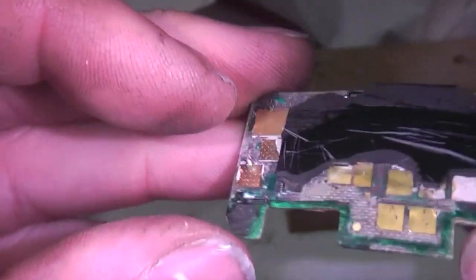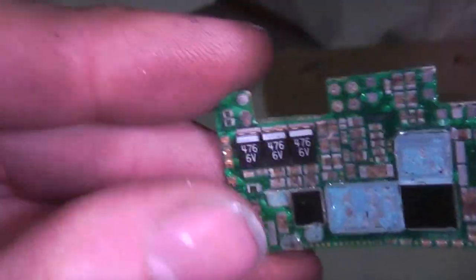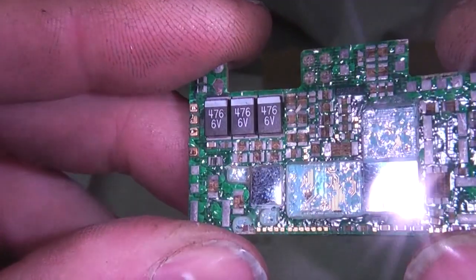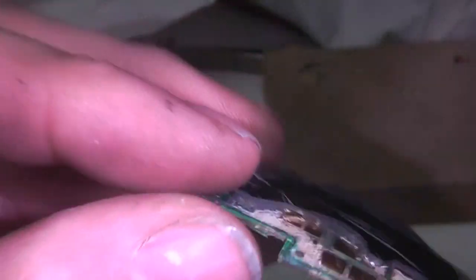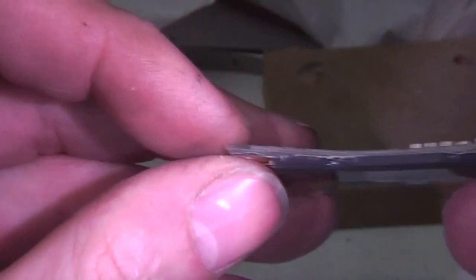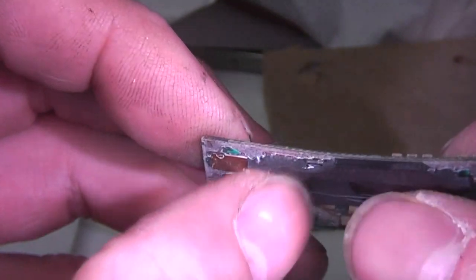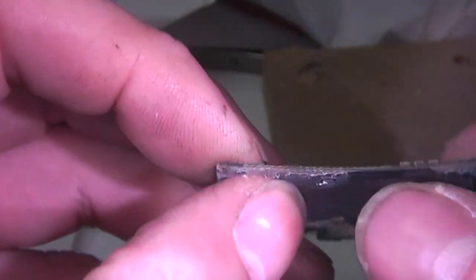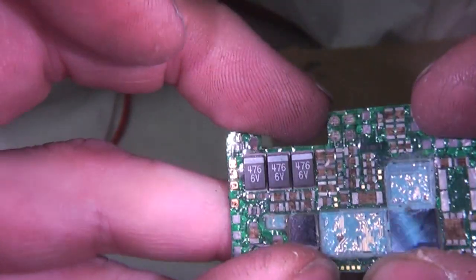Right, this PCB has now been sat in proper epoxy stripper, which I believe is dichloromethane and methanol. This has been sat there for about 3 weeks, and we've got a bit of movement. A couple of chips just popped off. I think what's happened is that the PCB itself has started to swell. This epoxy I think has also swollen a little bit around the edges. It was a bit soft and I managed to crack a few bits off, but I think it's just the curvature of the PCB has just cracked that chip off.